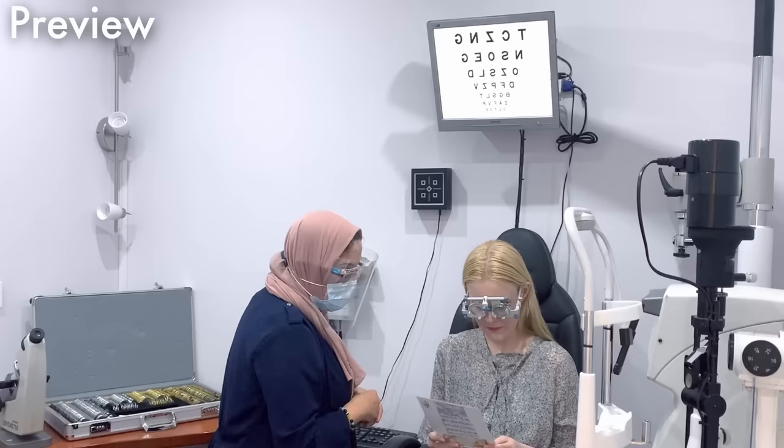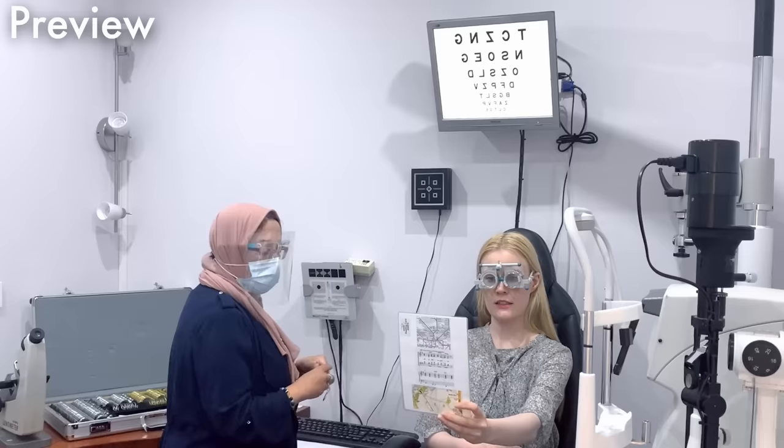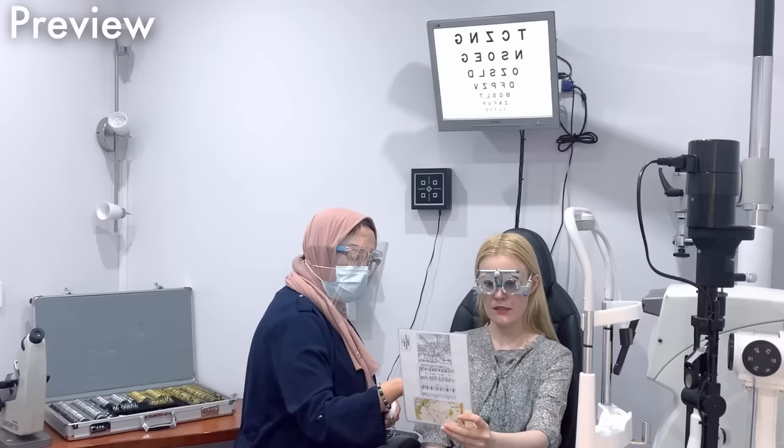So if you look at this reading chart, okay, you're still able to see the bottom line there. Yep. Yeah. And you know where you use your computer? Yeah. How far away is your computer, would you say? About this far, yeah. Okay. So we just take a measurement on it just to confirm. So it's about 52 centimetres roughly, okay? So keeping it there, are you able to see M10? There, yes. That one there. Yeah. Anything below that you can see? I think I can see all of it.